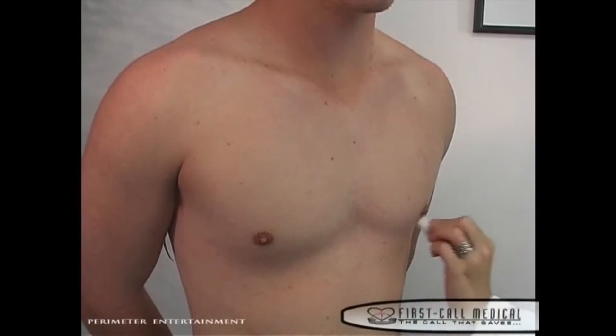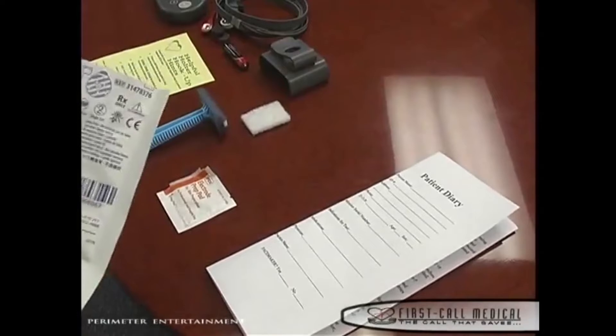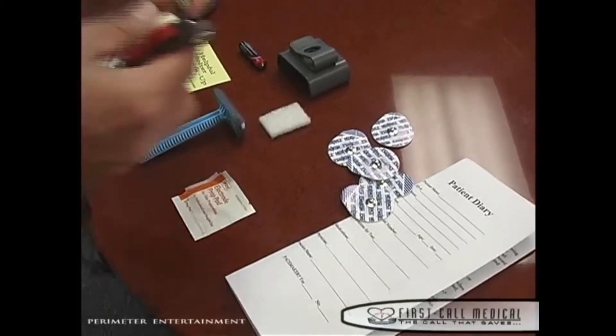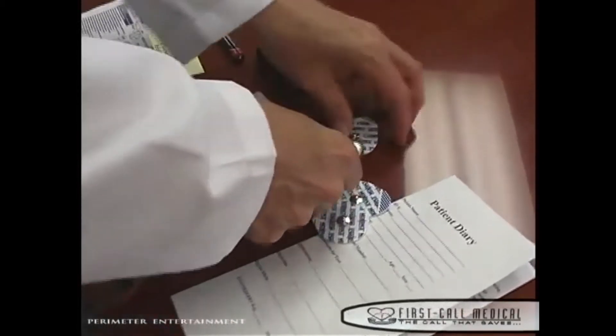We are now ready to prepare the monitor for application to the patient. Open one of the two packs of electrodes that contain the five electrode patches. Look for the number five in the upper right corner of the electrode pack. The other pack of electrodes is for backup in the event an electrode falls off. Place the five electrodes on a table and snap the five lead wires onto the electrodes.